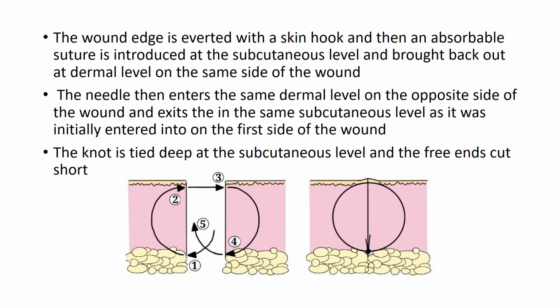The knot is tied deep at the subcutaneous level and the free end is cut short. Okay.